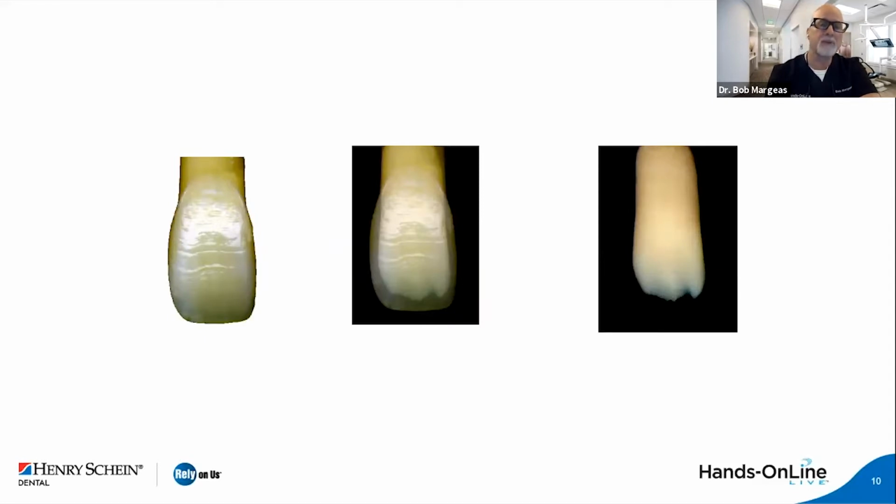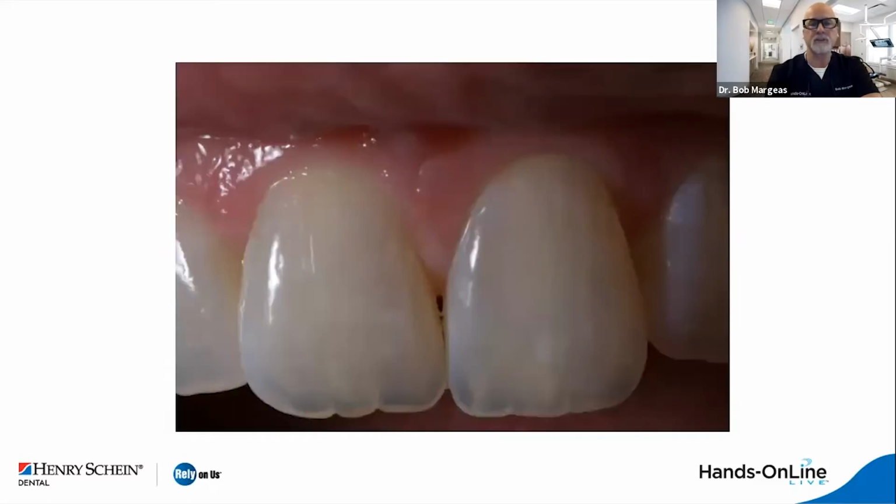So I'm going to build my tooth according to the anatomy of the adjacent tooth. And if I have a lot of translucency, I want to show you how you can create those incisal effects. Because look at this tooth. If a patient came in here with a class 4 fracture, I think all of us would find this very challenging, very difficult to restore, because we need to have a translucent shade on the incisal and the interproximal. Notice the dentinal lobes. See the chroma. The intensity of the color is greater toward the incisal edge, just little tips of color.